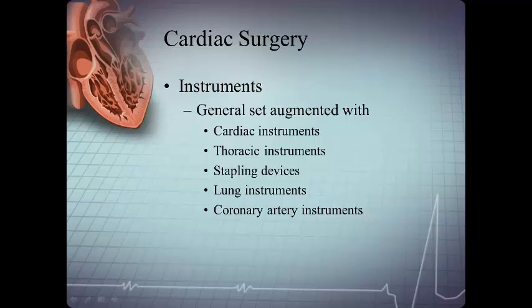As you can see, the instruments will be a general set with lots of additional specific pieces. The instrumentation can be quite complex. Exceptional organization is required during these procedures. You can understand now why the healthcare provider should be experienced before jumping into cardiac procedures. It's not uncommon for facilities to require a standardized setup for these procedures, so no matter what, anyone can scrub in and know exactly where everything is. There's no time for individualization of setups during critical cases, such as those performed in cardiac surgery.